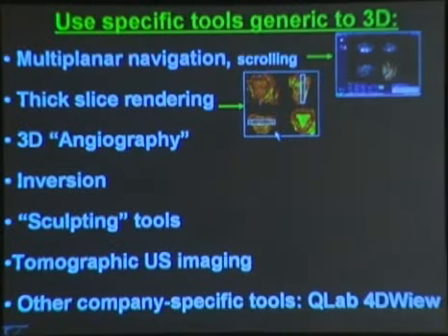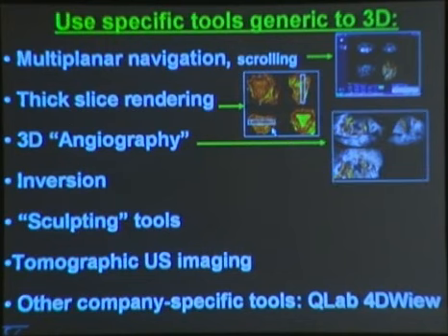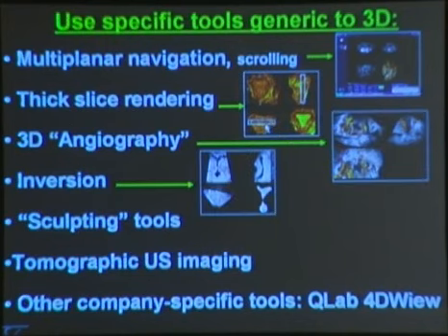Let me show you a little bit what the tools are, and they are very, very similar to those used in three-dimensional ultrasound in obstetrics, but also a little bit different. First of all, the multiplanar navigation and scrolling. We have the famous thick-slice rendering, which I will talk about pretty many times. 3D angiography, the inversion that Beryl talked about.